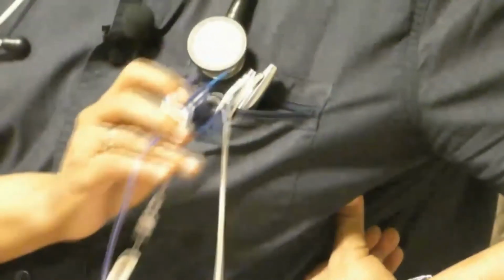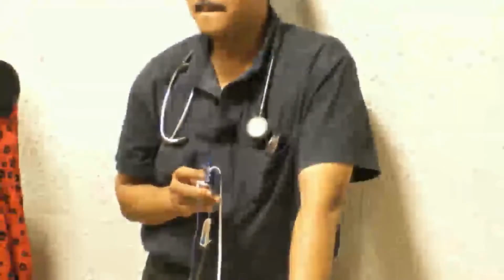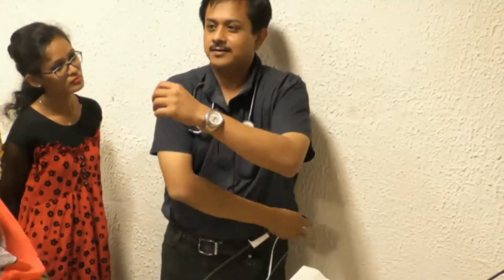My phlebostatic axis is here and your transducer is here. What will happen? Lower or higher? Right, lower. And if it is down, under?